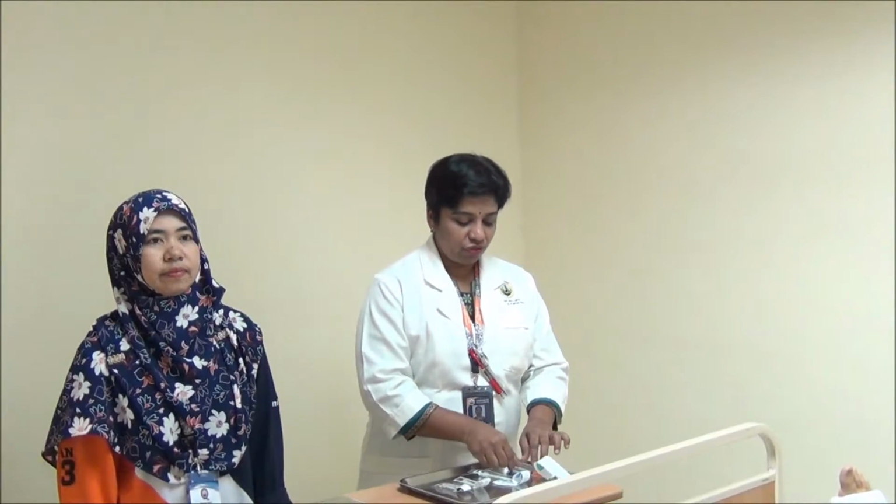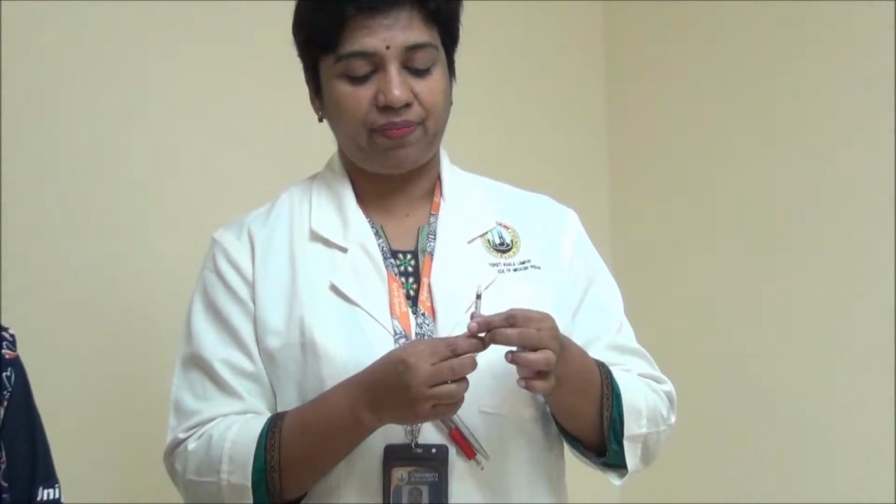For these insulin syringes, you don't have to change the needle throughout the procedure until you administer the injection to the patient. As for this tuberculin syringe, we need to attach the needle accordingly.